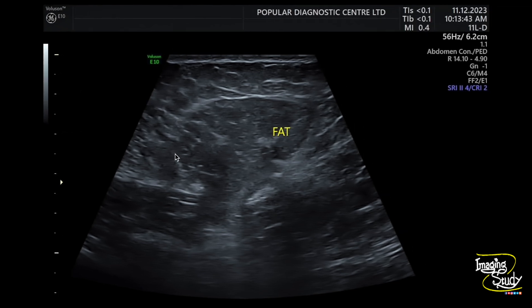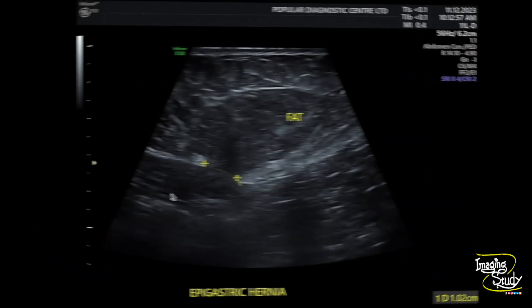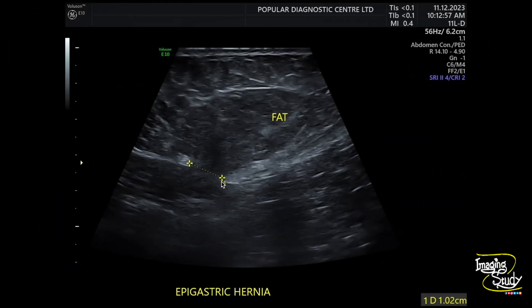Another picture of the midline epigastric hernia. The orifice diameter is around one centimeter. We applied color Doppler and there was no abnormal vascularity, though the pictures are not available here.